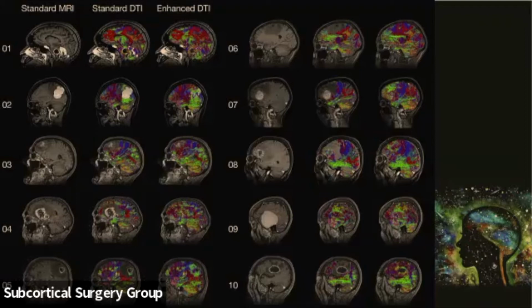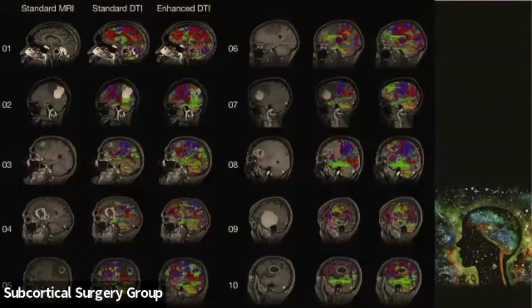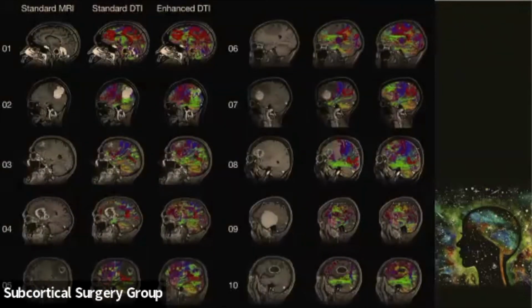The case on the other side is metastasis. Okay, so note that over here, the edema correction in this case adds tracts inside the tumor.